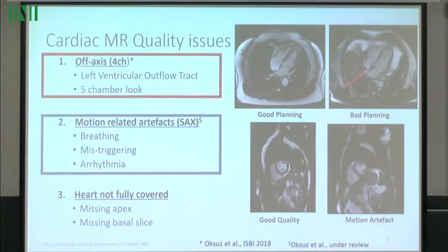One other issue which I will not cover today, but which is significant, is acquisitions not fully covered in the third dimension. There can be a missing apex or basal slice in the acquisition.